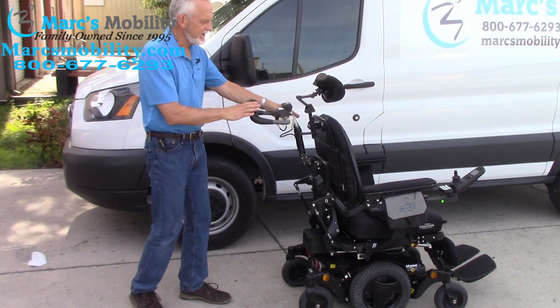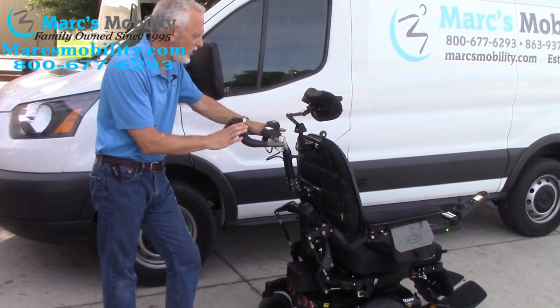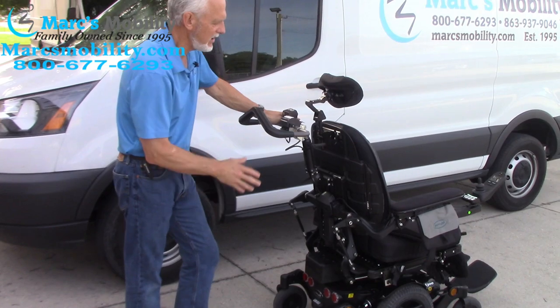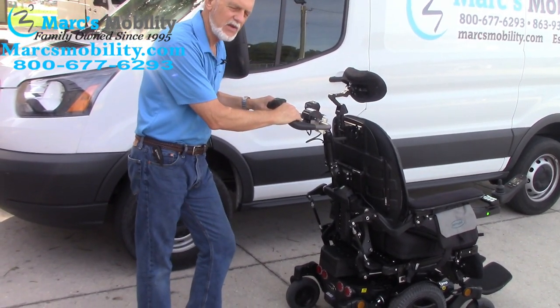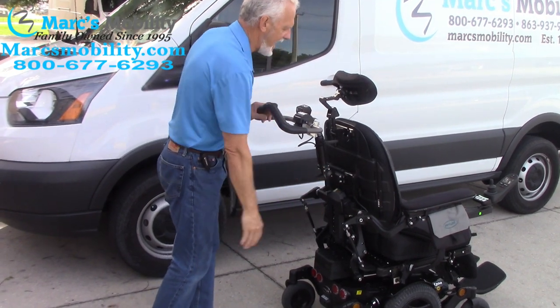So this is called the attendant co-pilot handlebars. It's made by Permobil. It goes on all the Permobil power chairs that have this type of backing. So if you're looking for something easier to drive and you have someone who cannot drive their chair and you have trouble with the joystick, this might be another option that will fit most Permobil chairs with this type of back.